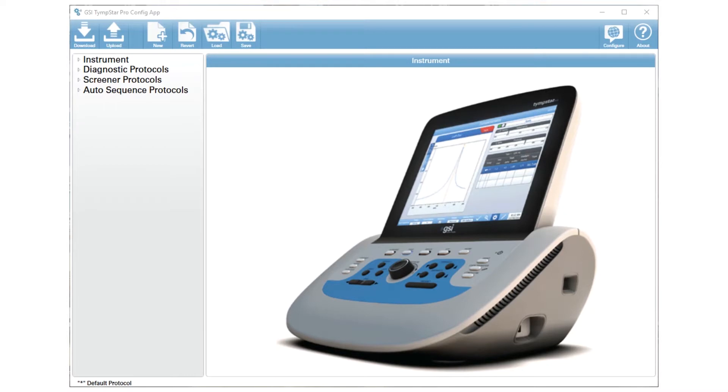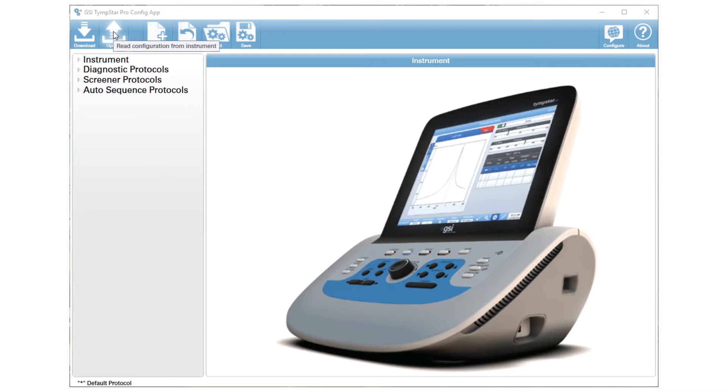Once you open that GSI TempStar Pro config app, the first thing you're going to do is press upload. Upload will bring all of the settings from your TempStar into this config app.